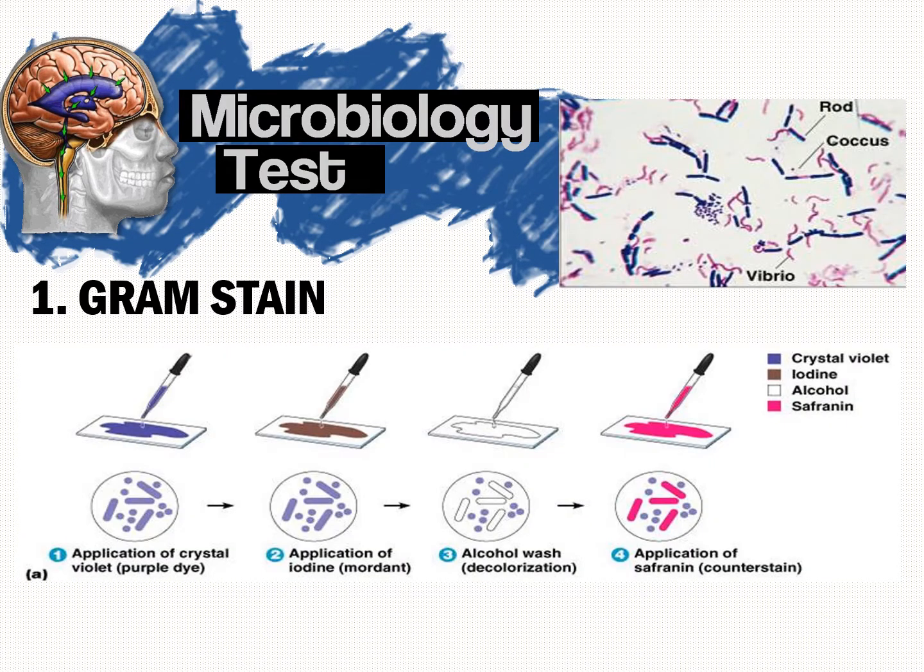Let us now discuss the tests performed under the microbiology section. The purpose of performing these tests is to identify the causative agent of meningitis. CSF culture is actually a confirmatory test rather than a diagnostic procedure. Further, if the volume of CSF collected is inadequate to fill more than one tube, so we only have one tube to work with, the first section to receive the specimen is microbiology, after which it can be endorsed to the other sections, like hematology for cell counts and chemistry for glucose and protein tests.